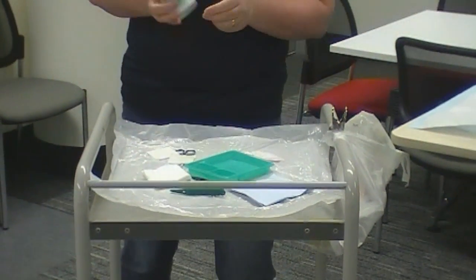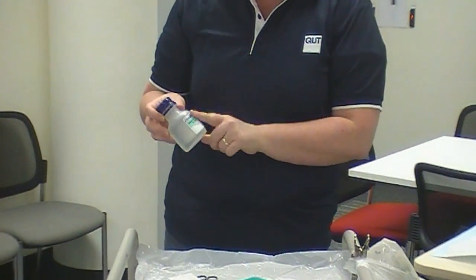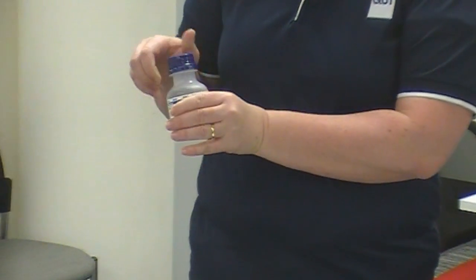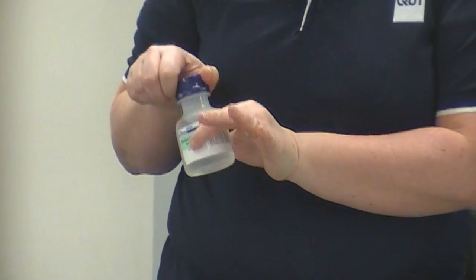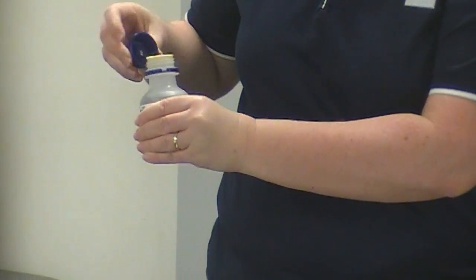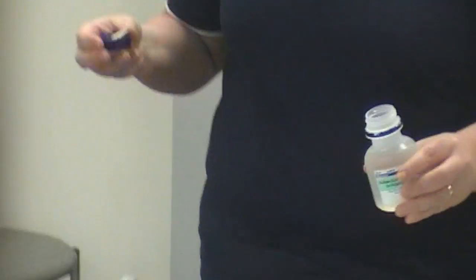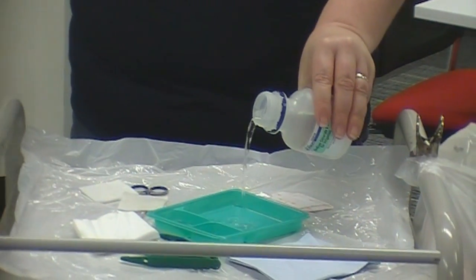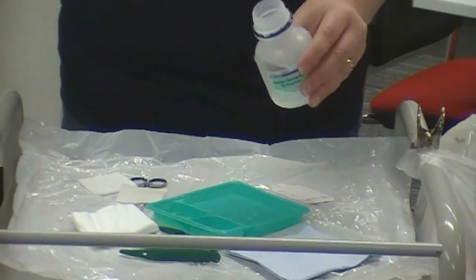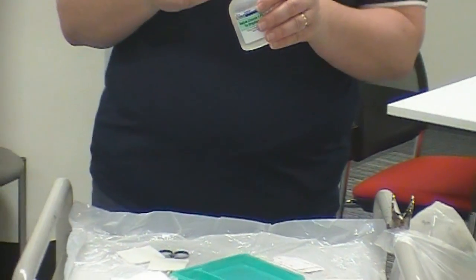The last thing I've got is my normal saline, so I need to check the expiry date, and if it's an opened bottle, when it was opened and the time, because if it's over 24 hours I need to get a new one. When I'm pouring, about 10 centimeters above my field, I always pour into my big one — it doesn't really matter — and pour in as much as you think you will need.